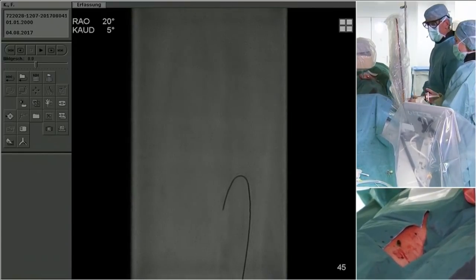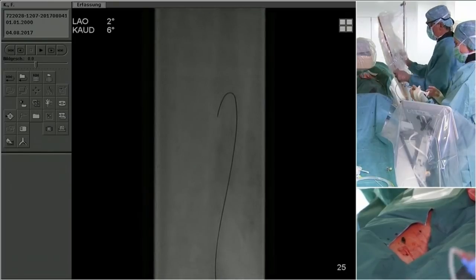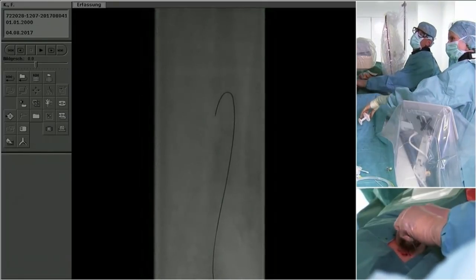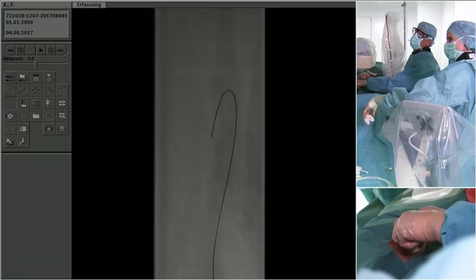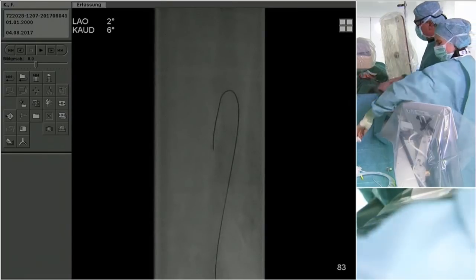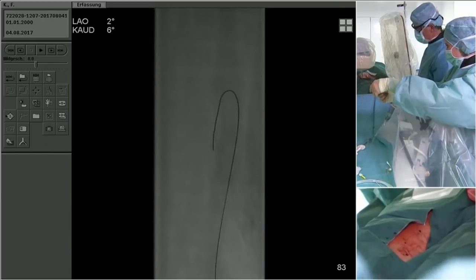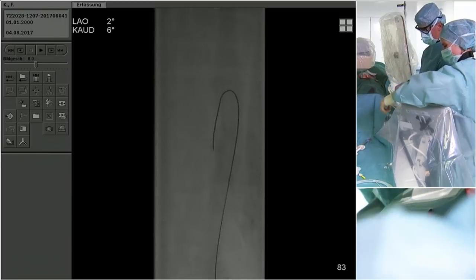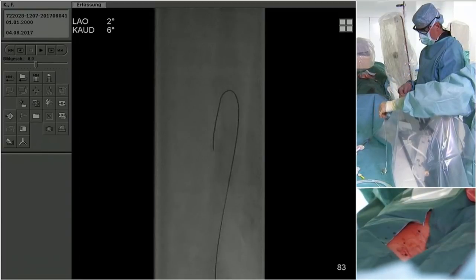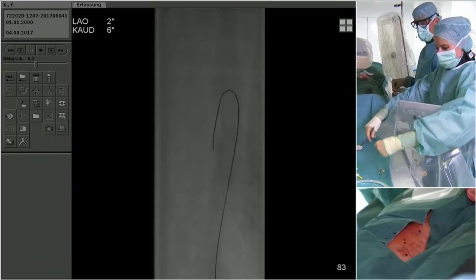Sorry, I don't know why it took so long. It's still a very big loop, though. It's a collateral. It's a branch? Collateral. Okay, branch. Let's take now the quick cross in and check. So, Andrej, what did you, in your opinion, have to adjust here? The depth of the needle was the main factor here, or so? Can you enlighten us a little bit?